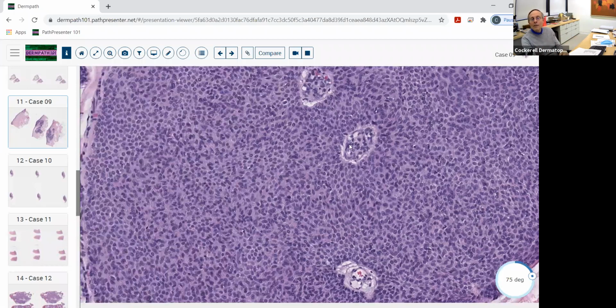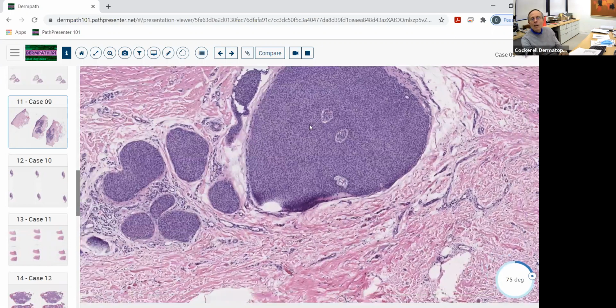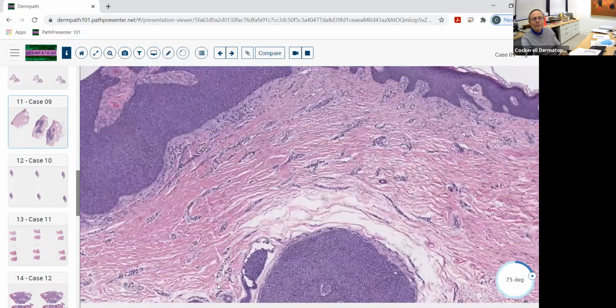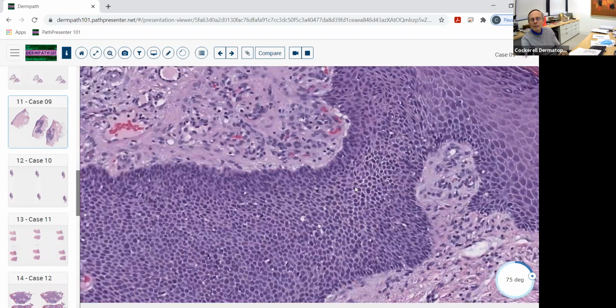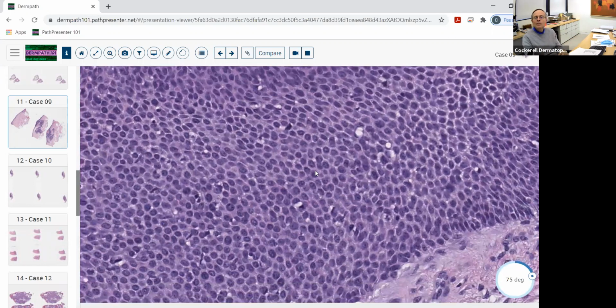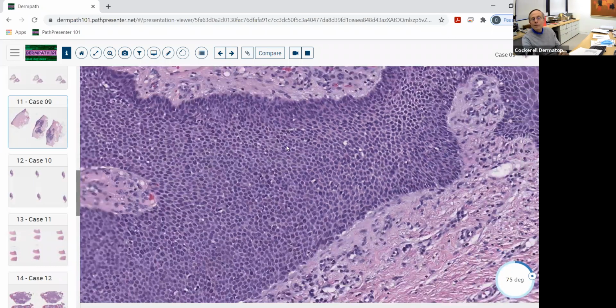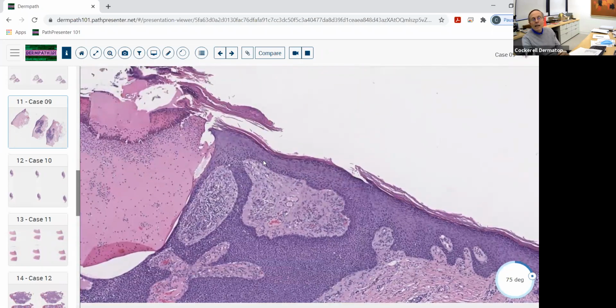But you can see these have dilated blood vessels. That's very characteristically associated with these lesions. But they all have the same type of differentiation. So you look up here in the epidermis, the areas that are contiguous to the epidermis, poroid differentiation. So we see this poroid differentiation in four lesions. When it's confined to the epidermis, it's kind of in situ, if you will, like in this area here, which we don't see a lot of here, we call that hidroacanthoma simplex.